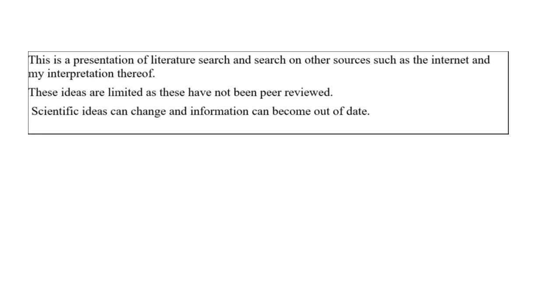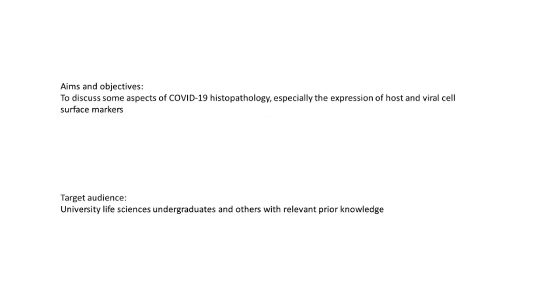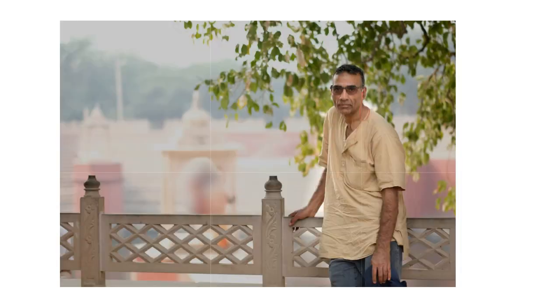And I shall be discussing some autopsy specimen histology slides and so on during this talk. Aims and objectives: to discuss some aspects of COVID-19 histopathology, especially the expression of host and viral cell surface markers. Target audience: university life sciences undergraduates and others with relevant prior knowledge.